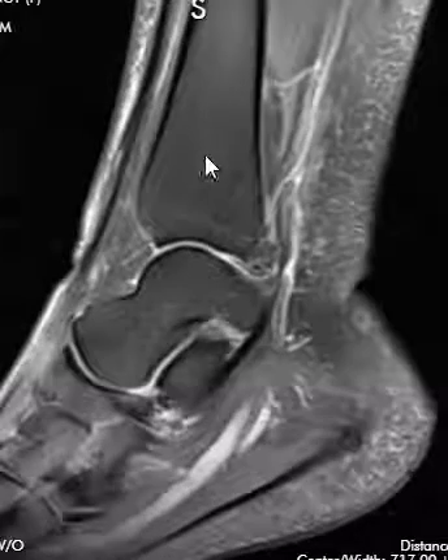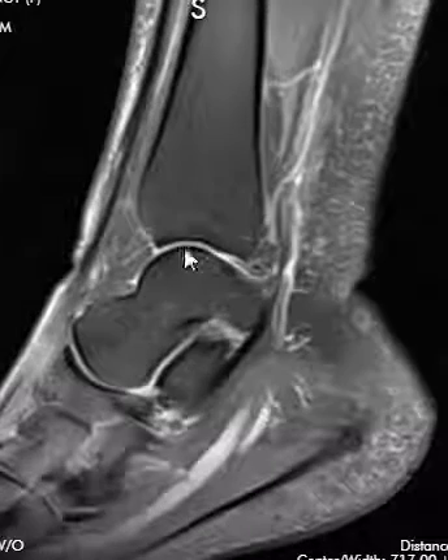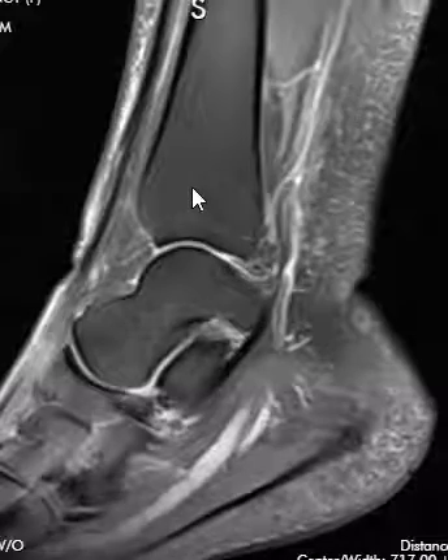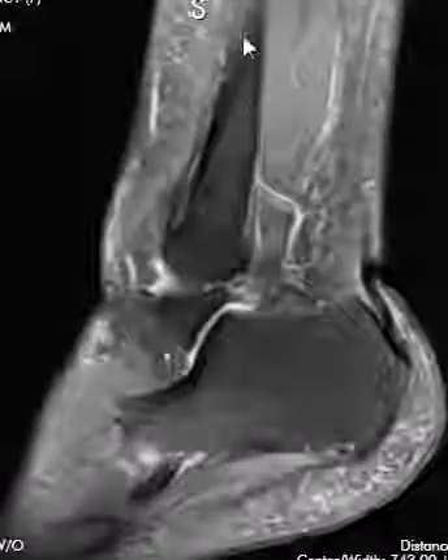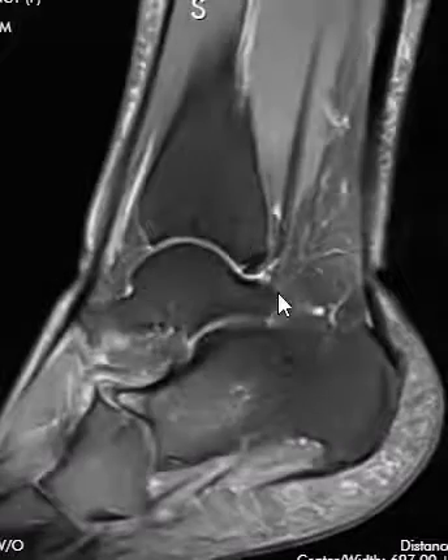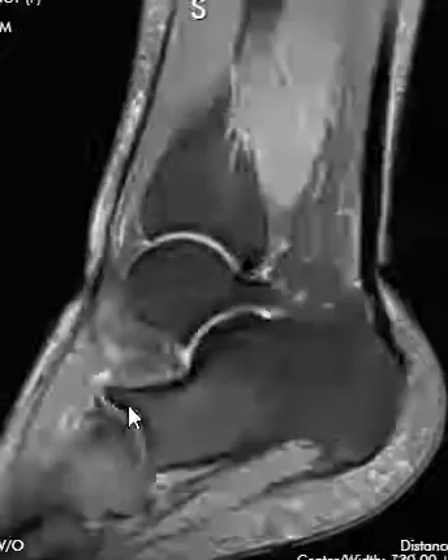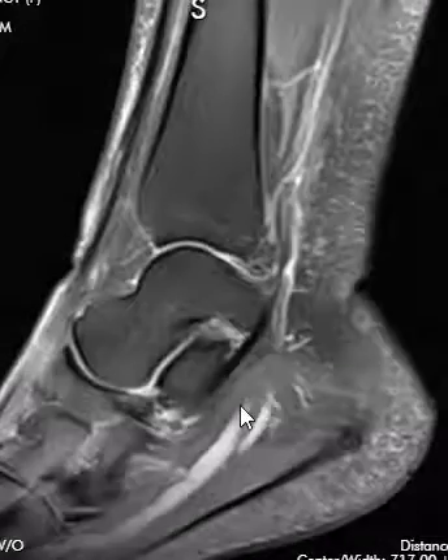Then we go on to look at the bones. This is the tibia — the big bone of the leg — coming down to the top of the ankle joint. This is the talus; it's round, so they call it the talar dome, and this is the ankle joint here. There's also a bone off to the side called the fibula, which is a smaller bone. We look at all the bones — this patient did have some arthritis over here at the front of the calcaneus, but the rest of the bones look pretty good.